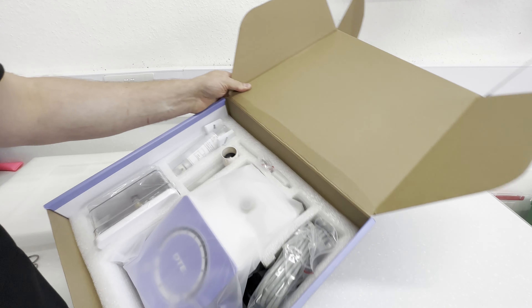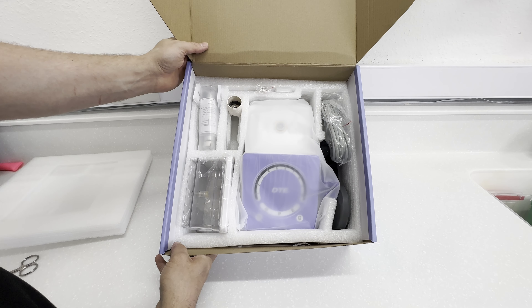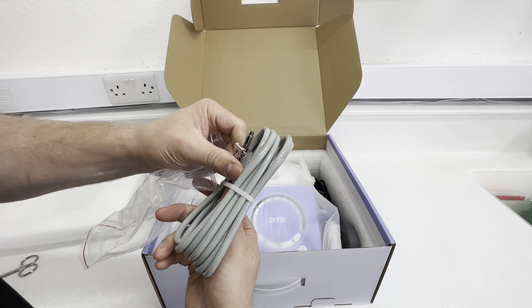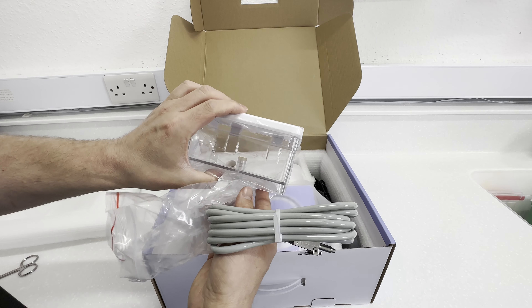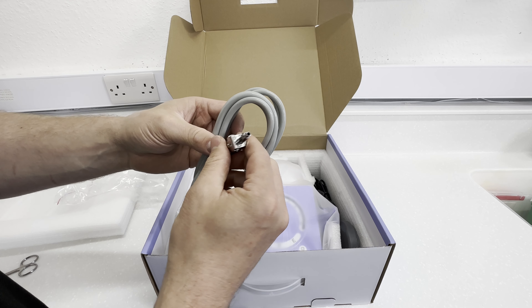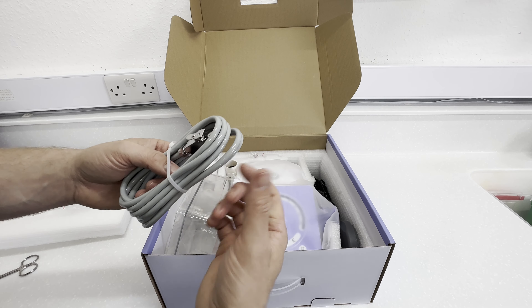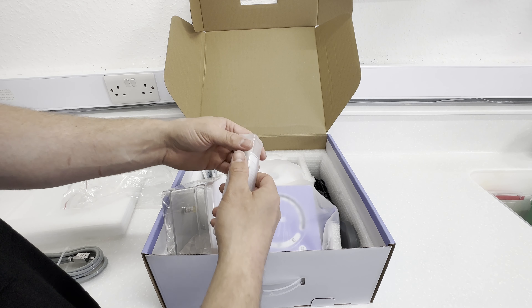And then we've got the unit itself. I was actually going to get a box for this but I'll probably keep it in this box since everything's there for you. I believe this connector is to plug directly into a dental unit so you don't need to fill up the water tank specifically. My chair has this but the plug is on one side of the chair and the cabinet is on the other side, so I'll probably use the water tank.